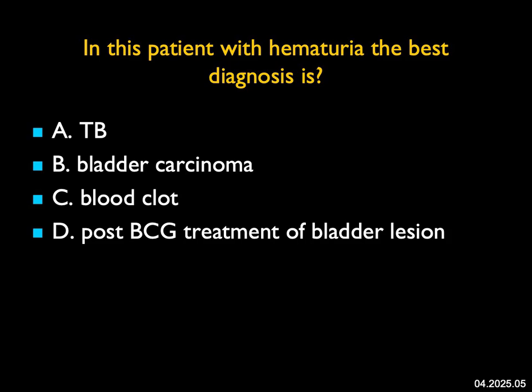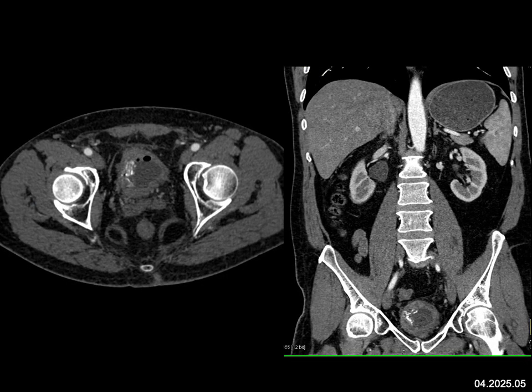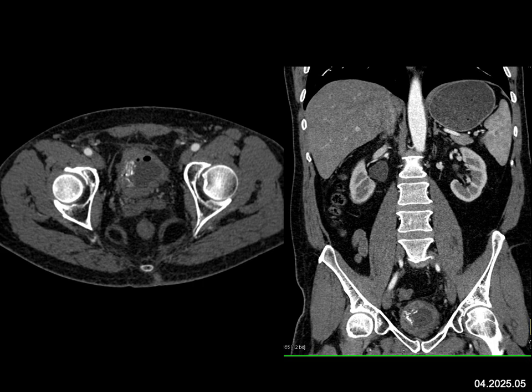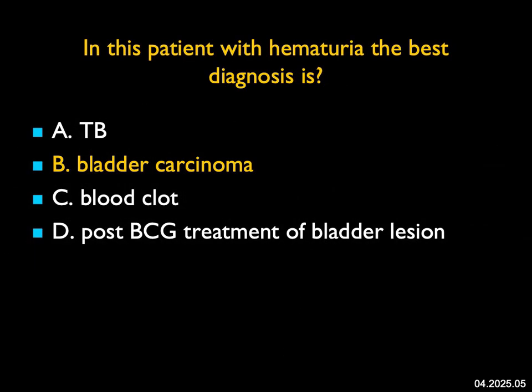In this patient with hematuria, what's the best diagnosis? When you look at the kidneys, they look okay. But when you look at the bladder, there's diffuse wall thickening on the right side — asymmetric thickening with calcification present. When you have a bladder lesion with calcification, you've got to think about malignancy. TB can cause a bladder lesion and it can calcify, but usually it's more extensive with thinner calcification. This is not a blood clot because the high density excludes that. BCG treatment of a bladder lesion can also result in calcification. With a history of hematuria, the best diagnosis till proven otherwise is bladder cancer — asymmetric wall thickening with calcification.